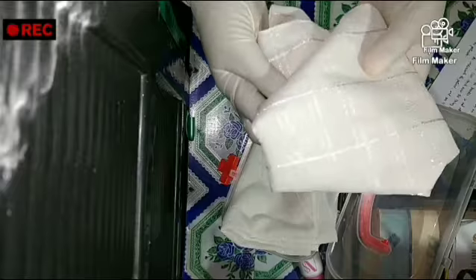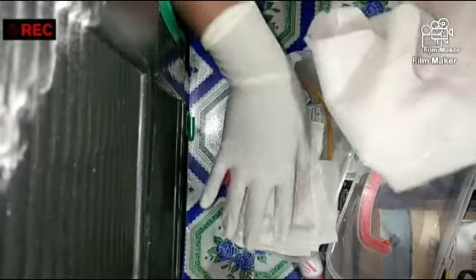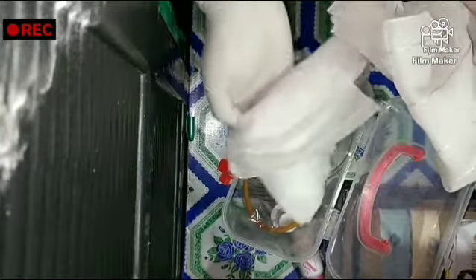So just assuming that this is a sterile kit, it's away from us and side and toward. Remember that the border is not sterile, the inside is the sterile, and the other one is for exposing only the genital of the patient.